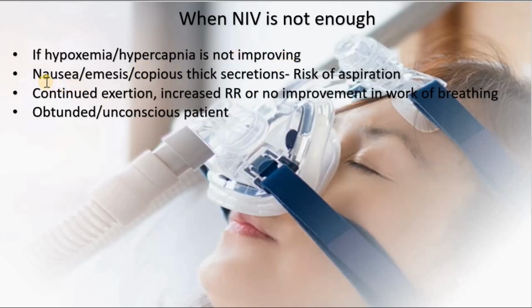Another indication is the patient has complaints of nausea, emesis. These patients placed on BiPAP are at high risk for aspiration. They can aspirate the gastric content into the lungs, leading to aspiration pneumonia. They should not be placed on BiPAP. Another is copious thick secretions. This needs to be suctioned out, or the patient has to cough out these secretions.